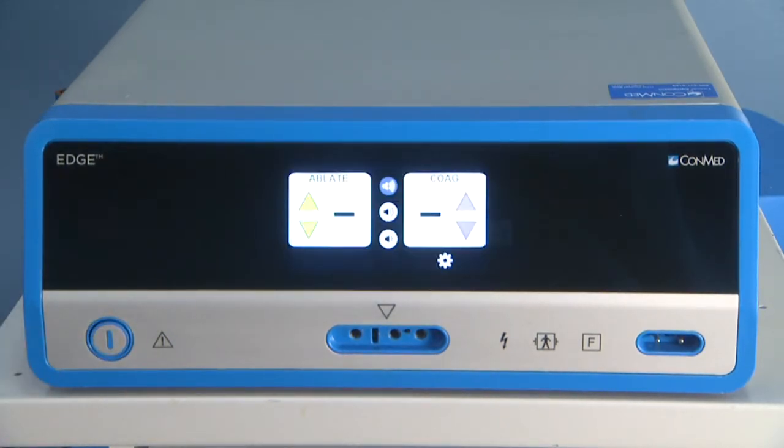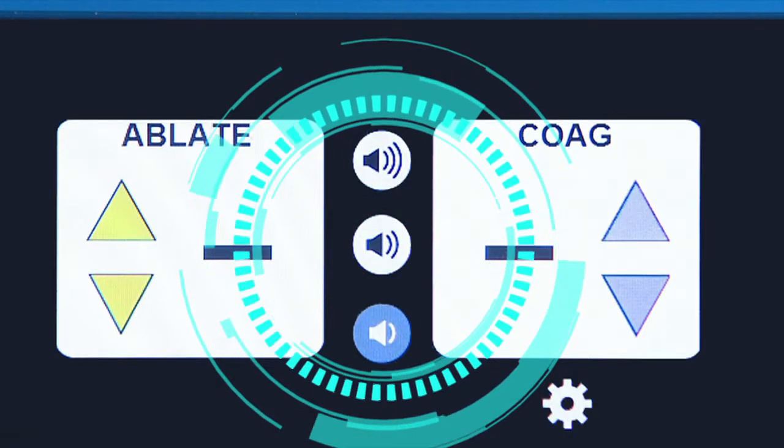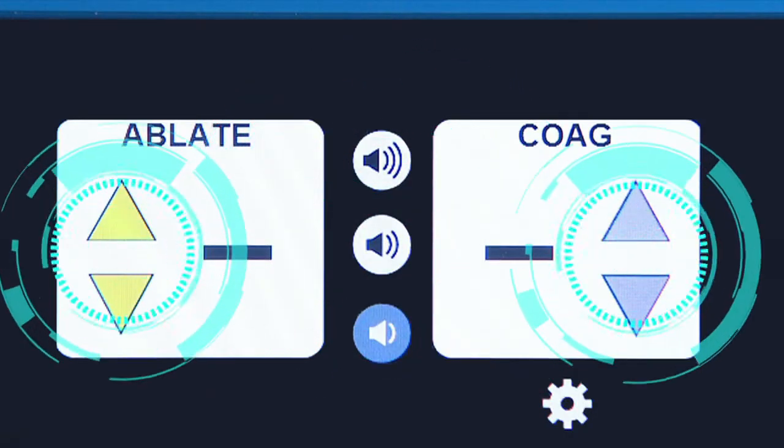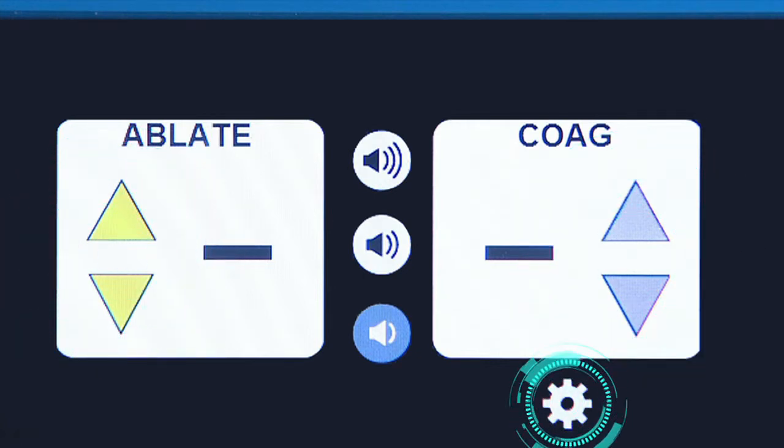You'll see the touch screen interface come to life, which allows you to easily select a preferred volume level for alerts, quickly adjust ablation and coagulation power levels, and promptly access system settings.